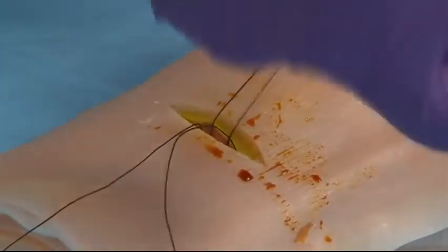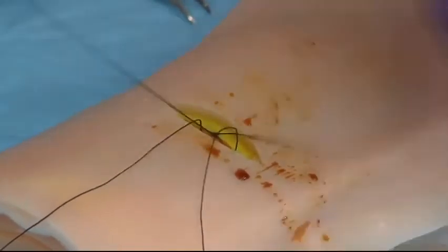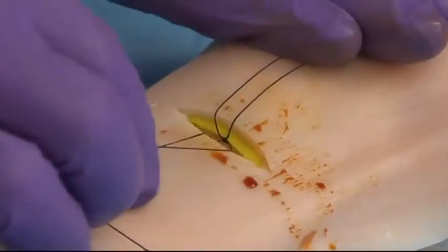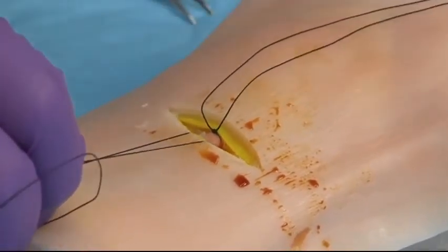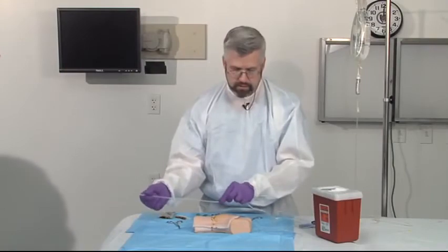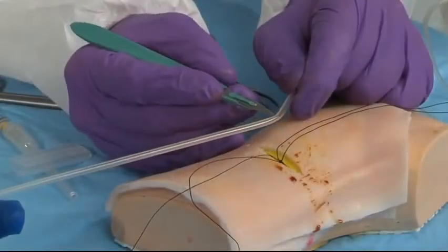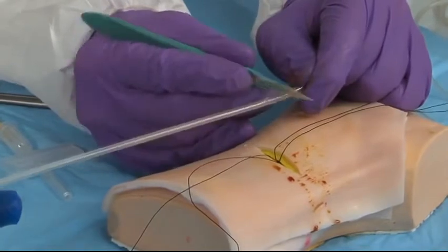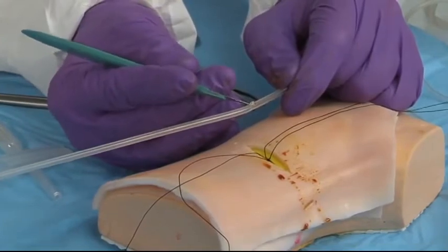So I'm going to tie this down. The next step is you want to make sure that you cut the vessel at an angle but not completely transect the vessel so that you can get the IV into it. One of the tricks you can do for that is — if you imagine that this piece of IV tubing is the vessel — you will place the 11 blade perpendicular to the vessel going from one side to the other, and then angling it up and out towards the foot. What this does is raises a flap that you can then effectively place your IV into.